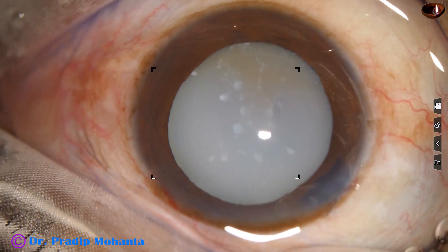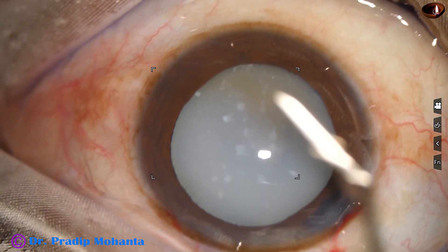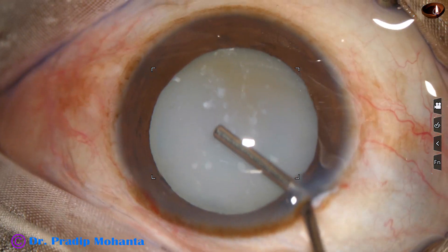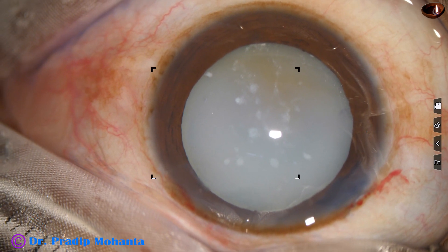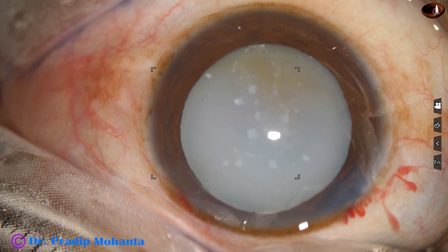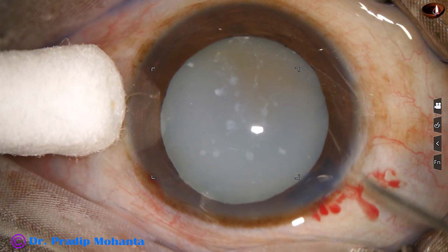Whenever milky fluid comes out, it means a hypermature morganian cataract. The challenges in such cases are that the nucleus is free-floating and it is very difficult to hold the nucleus.